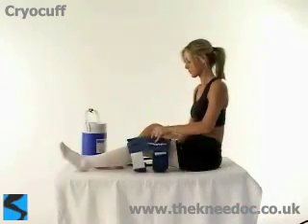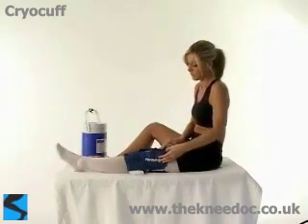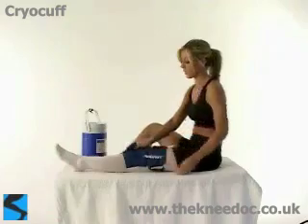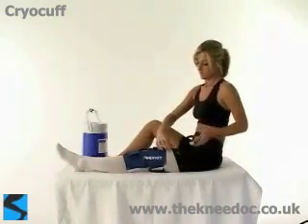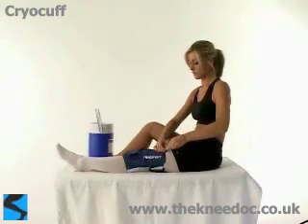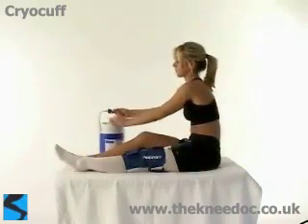The other method of emptying the sleeve is to take the sleeve off the knee once it is full, connect the nozzle to the canister, open the nozzle and hold the sleeve above the canister so that the water flows out. Once it is empty, the nozzle is disconnected and the sleeve can be reapplied to the knee empty to then be filled once again.